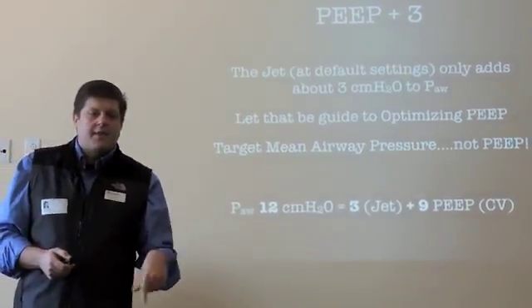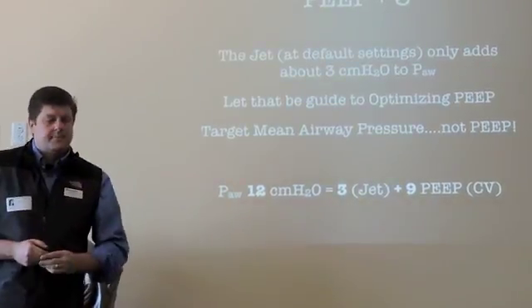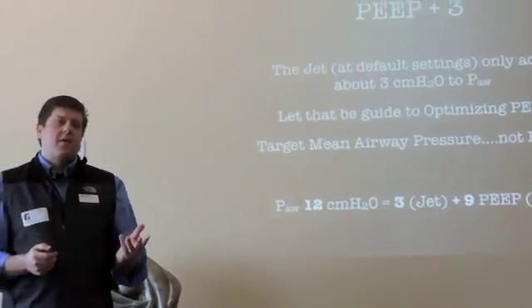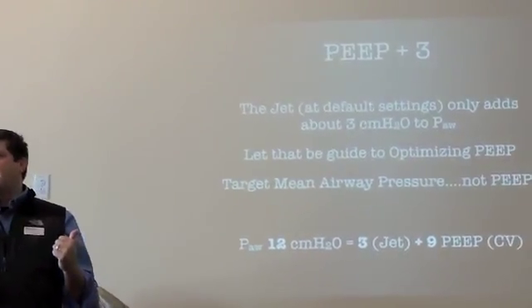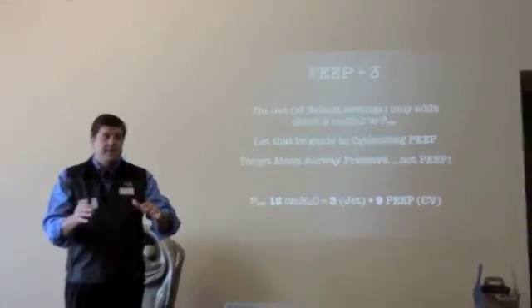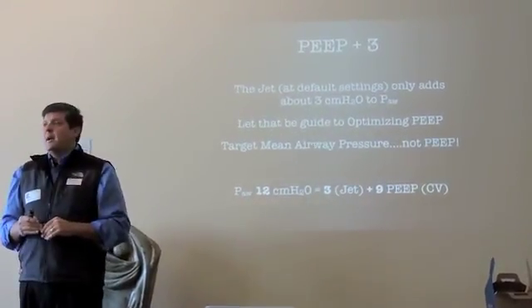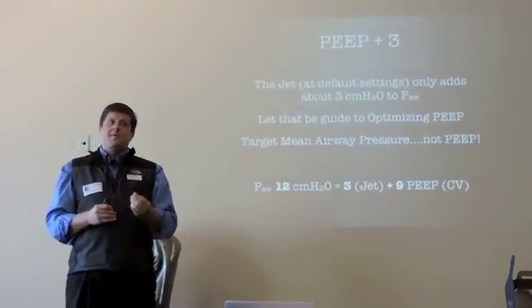And this kind of rule of 3 I've used for, golly, nearly 20 years now. It works very, very well to not underestimate. One of the biggest pitfalls of using the jet is when you first start out on the jet. That's where people freak the most, and where patients have issues. Why? I think it's often because we underestimate the PEEP that we need when we first start off the jet.